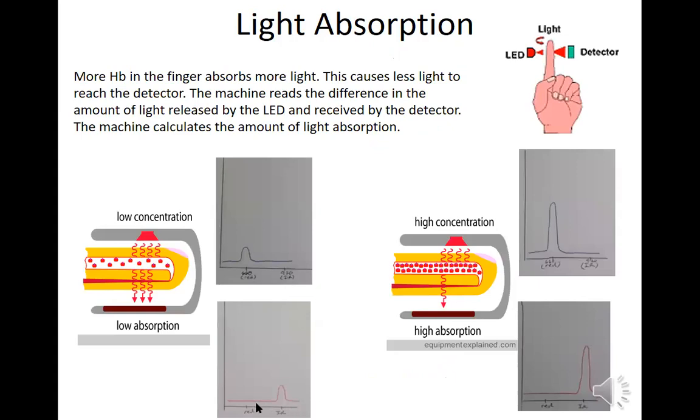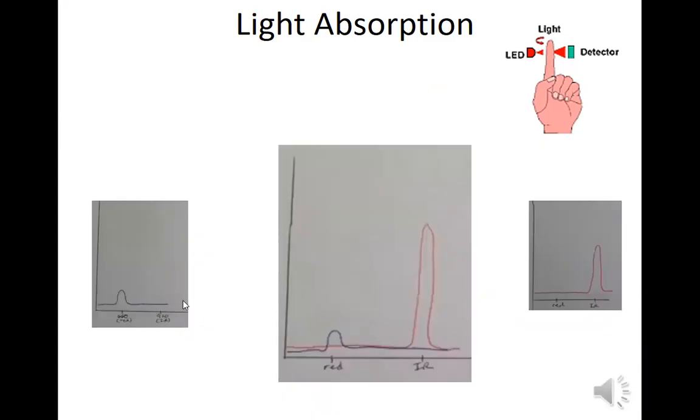So this is good. It shows the infrared light is being absorbed. It shows how much, so it's a concentration. This is kind of a good picture because it shows less. It shows more of that diode light going to the sensor, whereas with more oxyhemoglobin, less is reaching the sensor, right? So that's how it's done. Again, if you mix these both, you can see that there's more infrared light being absorbed in the finger. So this is good. We're not doing this calculation, but you can see that there's more oxyhemoglobin than there is deoxyhemoglobin, also known as free hemoglobin or reduced hemoglobin.